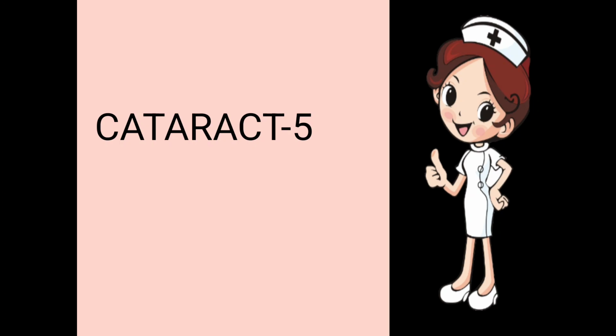But in some cases, for example in case of vitreous hemorrhage, or a highly developed cataract, like a Mature cataract or posterior polar cataract, it is not able to give the axial length of the eye of the patient. So in those cases, what is to be done? We have two methods.